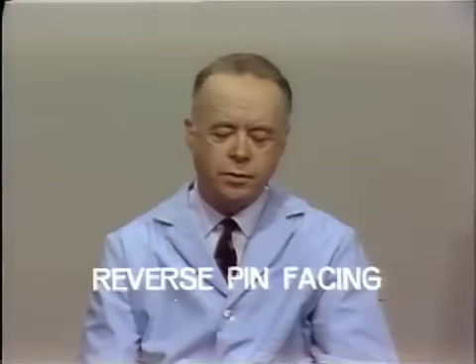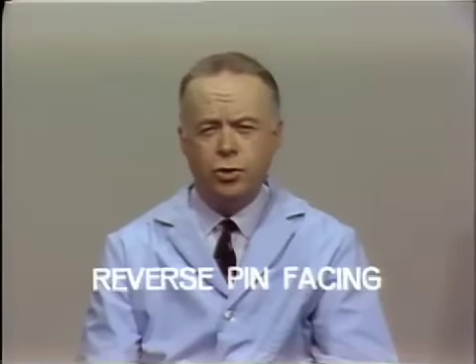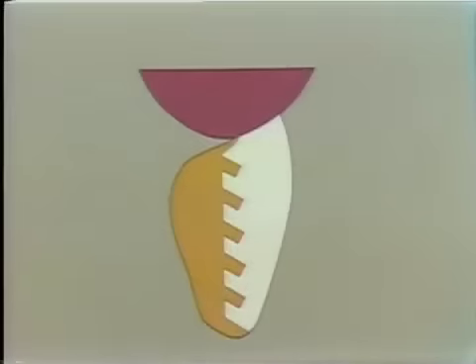The reverse pin facing was developed 10 years ago or so by Shushan. It has the advantage of allowing almost any porcelain tooth to be used as a bridge facing. And so it opens up for our access the whole range of denture porcelain teeth in all their many shades, molds, and characterizations. The essential nature of the reverse pin facing Pontic can be seen on this diagram here, in which you see a typical Pontic for a maxillary anterior tooth, in which this would be porcelain on the labial surface, and this is the gold backing on the lingual surface of the tooth.